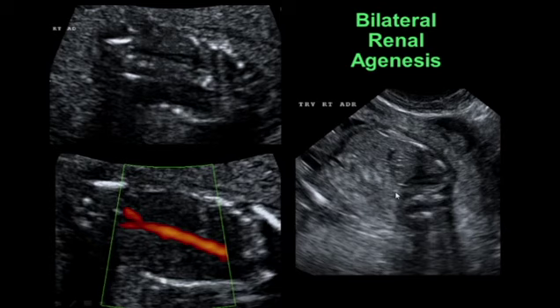So here's a fetus with bilateral renal agenesis. You can see on this transverse view of the fetus that there is virtually no amniotic fluid around this fetus. You'll see the same on the two longitudinal views. No amniotic fluid whatsoever inside the amniotic cavity. On longitudinal view, we saw the adrenal glands lying parallel to the spine. On transverse view, we saw no kidneys in either renal fossa. And this was also confirmed with the power Doppler showing no renal arteries coming from the aorta.